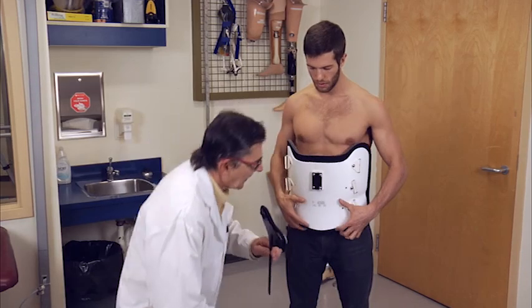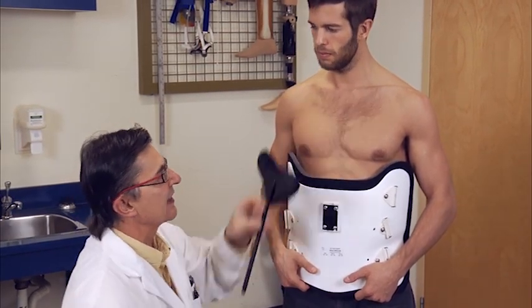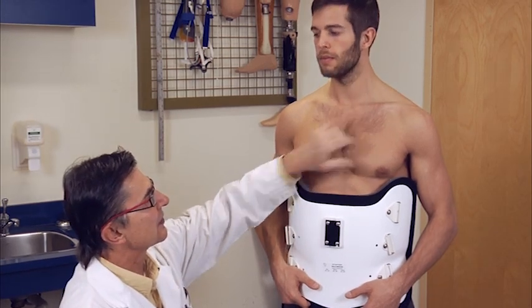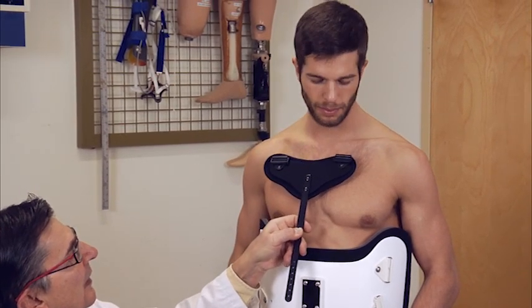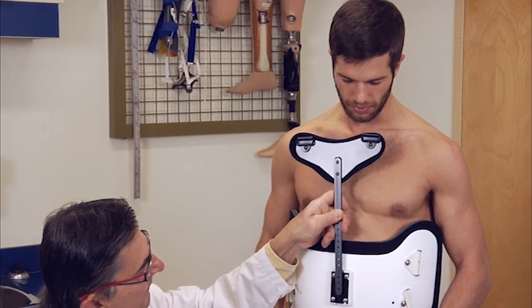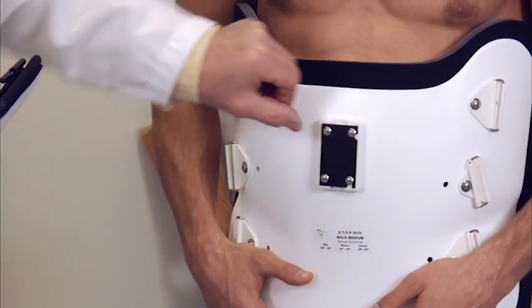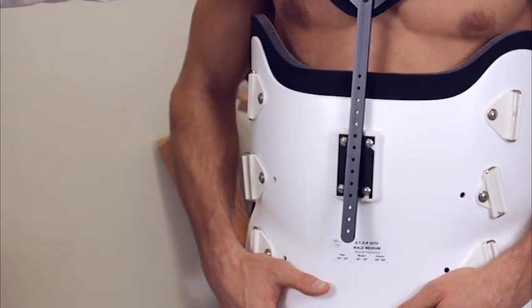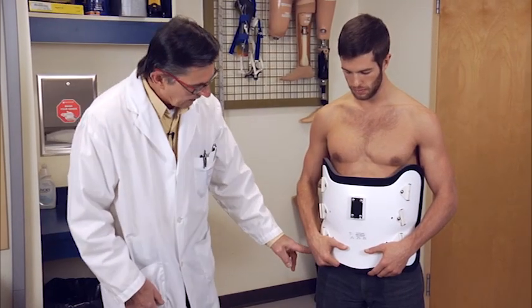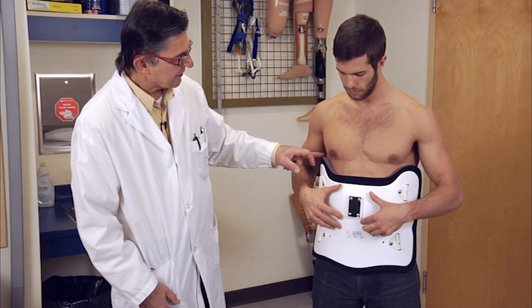In conjunction with the anterior portion, we have what's called a sternal pad. This holds the back into extension but with greater control because we're going further up on the chest. You don't want to catch the sternal notch — apply it down on the upper part of the pecs, on the sternum. This goes into a slider with Phillips screws; you undo a couple of screws, flip it up, and lay it on the patient. The measurements needed are: a hip measurement at the level of the trochanter, a waist measurement at the level of the navel, and a chest measurement at the nipple line.